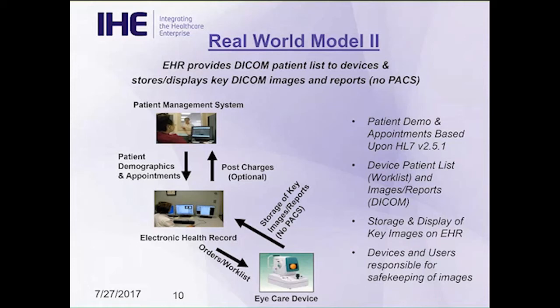So a difference that a device system has to be able to manage is the ability to select the key data and send it to the EHR. You don't just blast everything. I just don't give you everything I've got. I give you the key images, the images that the doctors wish to display and store, and that gets put into your electronic medical record. And so that's the key difference from a device point of view.